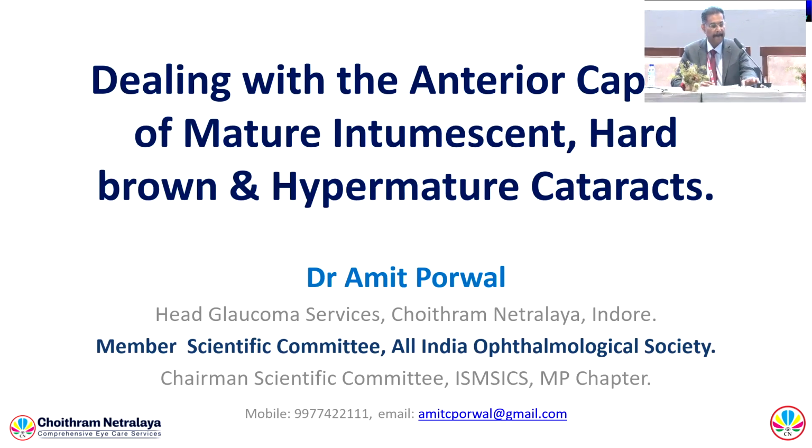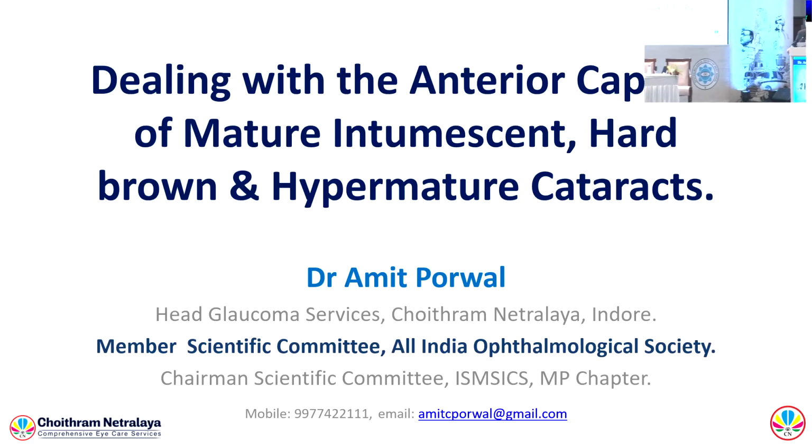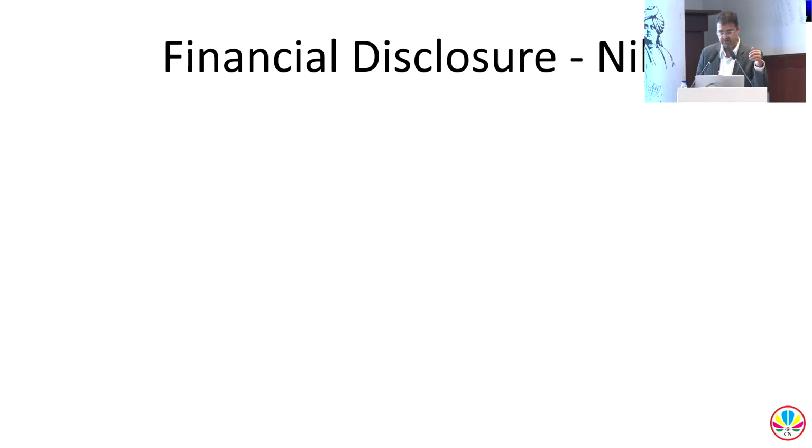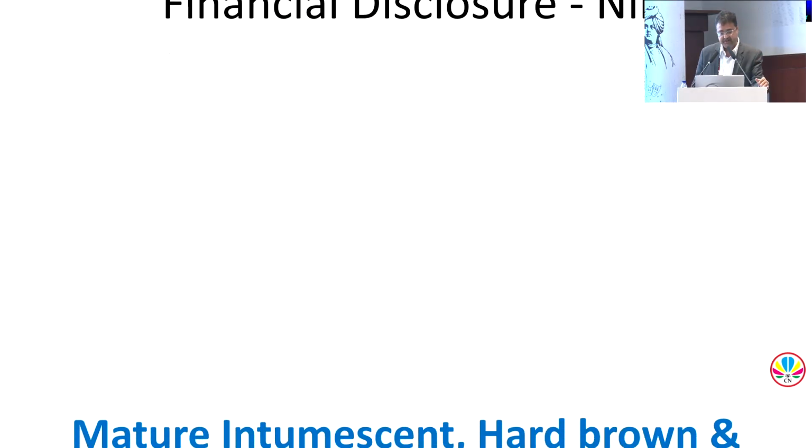Thank you, Dr. Minu. And for the audience, most of the tips will be the same, most of the procedures will be the same for the rexis, what everybody's been talking about. The cataracts also are the same. They'll be hard, mature, intumescent, soft. But every surgeon has one tip, which if you can pick it up and take back, it will be very advantageous to you all. So no financial disclosures.